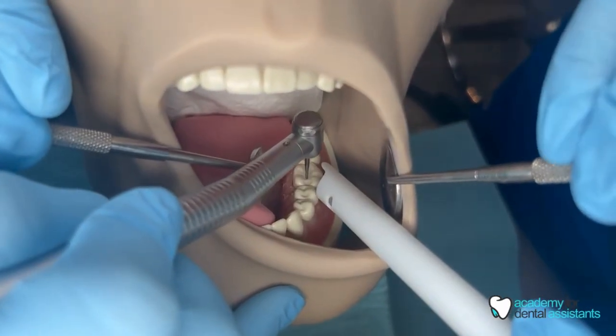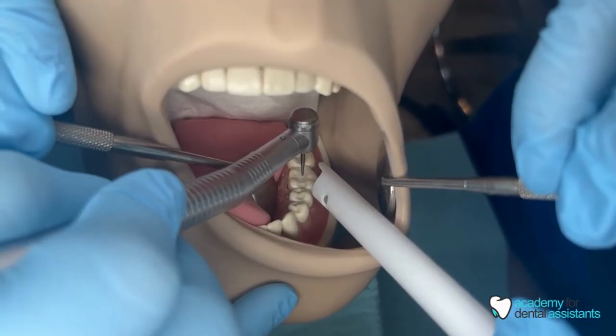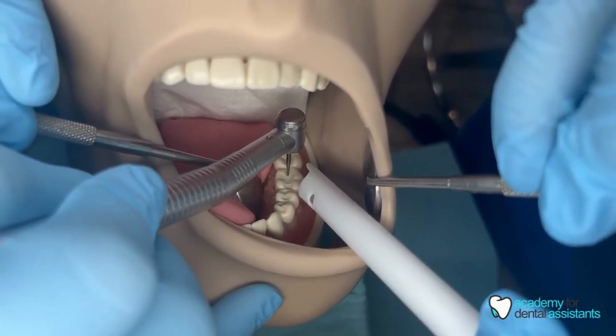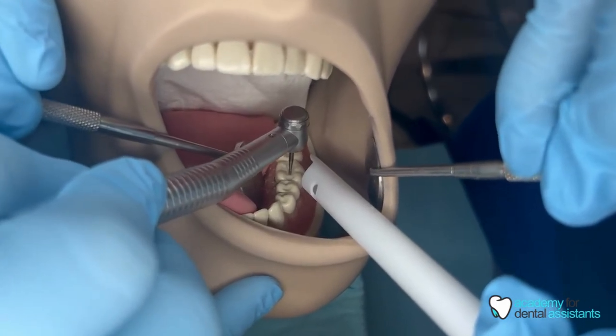Now the doctor is working on tooth number 19. We are using a mirror to retract the patient's cheek as well as the HVE. The doctor is also using their mirror on their side to retract the patient's tongue.